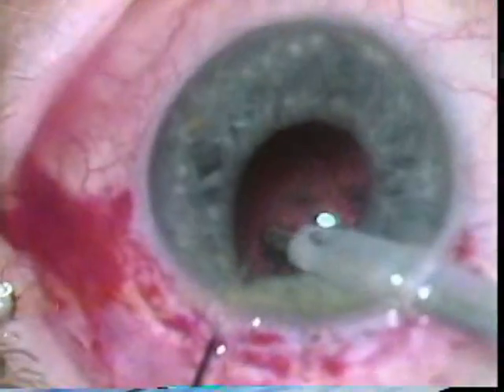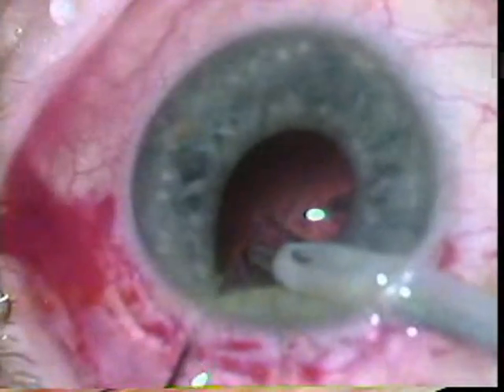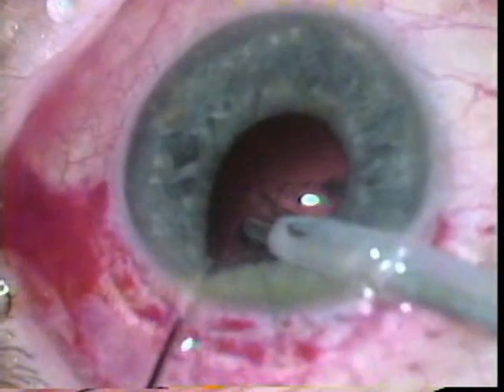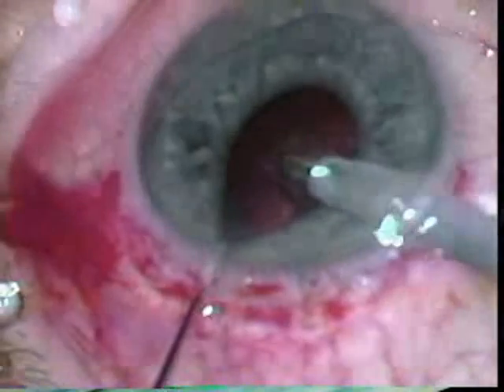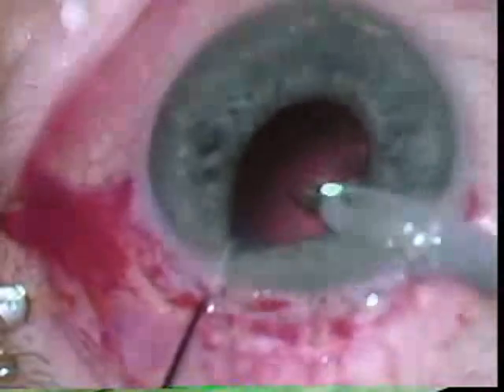Dr. Kolder is doing this two-handed technique which is very difficult. He had such excellent hands, but it's very hard to do. He's using the Kuglen hook to expose some sub-incisional material here.